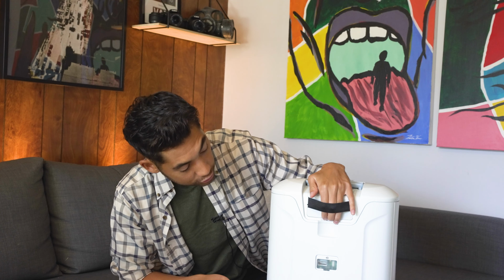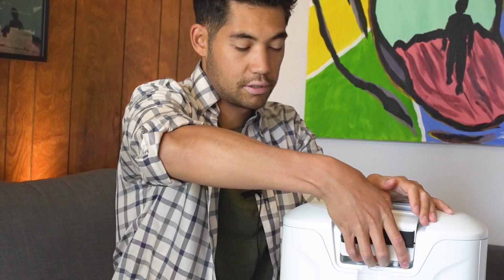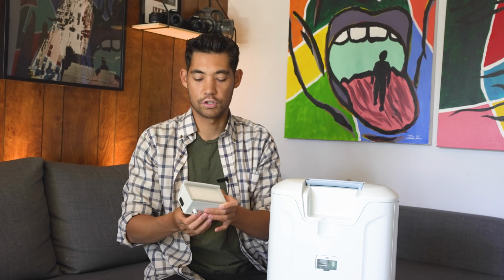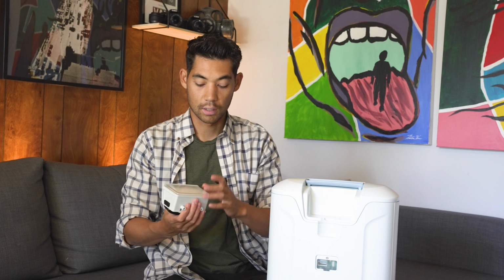The second filter is the back inlet filter right here. So you can just pull it off straight up like this. And you can inspect the filter if it's looking a little bit degraded or dirty or what have you. Generally, this filter is gonna last between 3 to 5 years. Most patients replace it every 5 years. Or if you're changing patient to patient, you might wanna replace this filter.